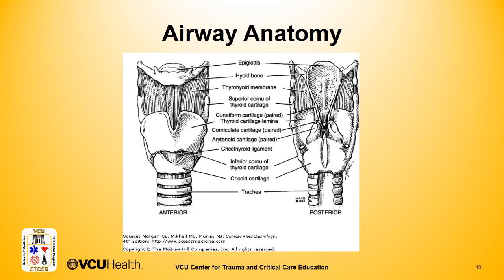Once you get down to the layer of the larynx, where you have the palpable thyroid cartilage and the palpable cricoid cartilage and the cricothyroid membrane in between, at this point, you are now going to make a horizontal incision through the cricothyroid membrane. Looking at this picture explains why we do a horizontal incision. The cricothyroid membrane is longer in width than it is in length. So you can make a longer incision from side to side than you can from top to bottom.